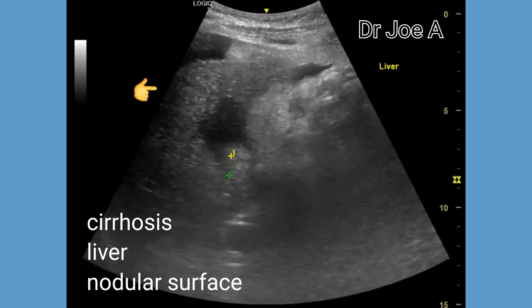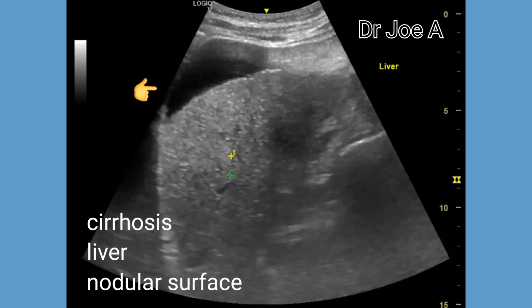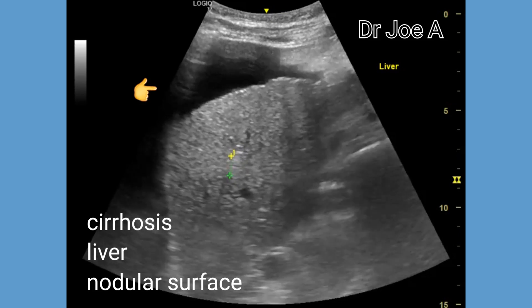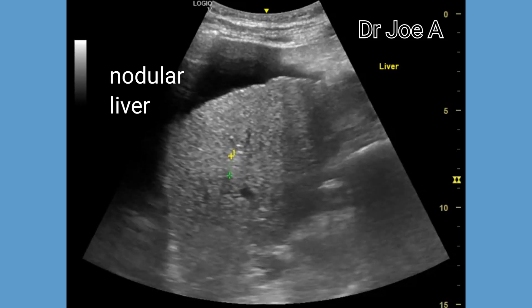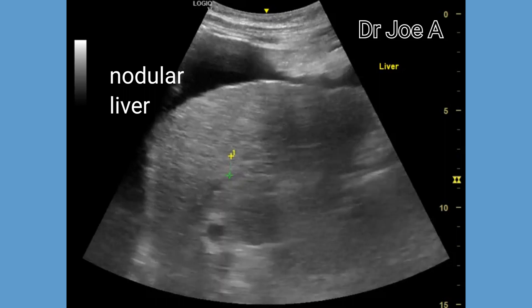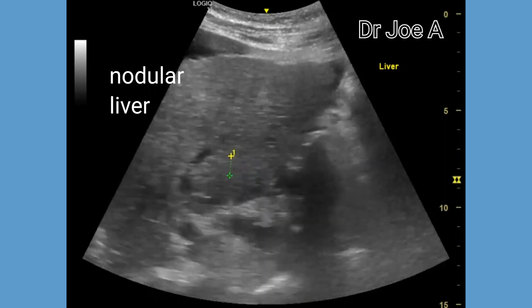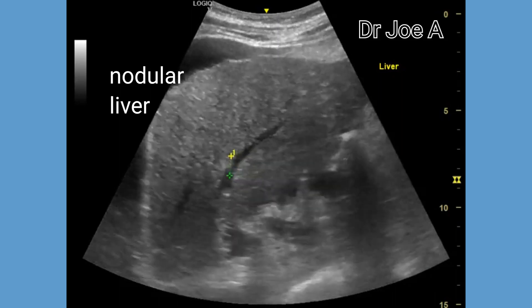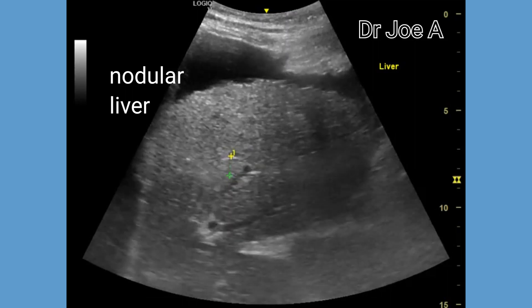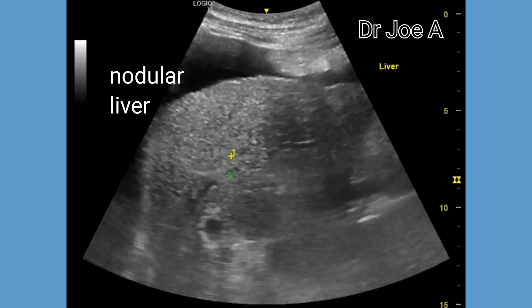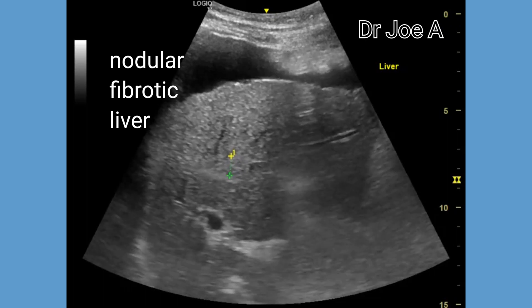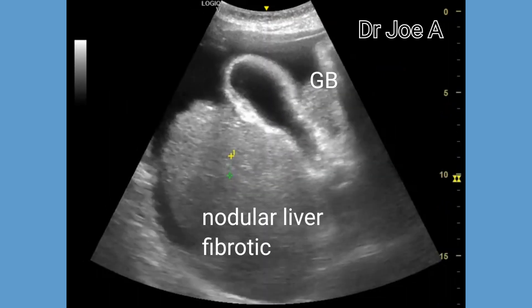Now we move over to the liver, which appears nodular and bathed in ascitic fluid. Observe the surface of the liver outlined by ascitic fluid, showing nodularity. In addition, the liver is fibrotic and shrunken in size, suggesting advanced cirrhotic changes.